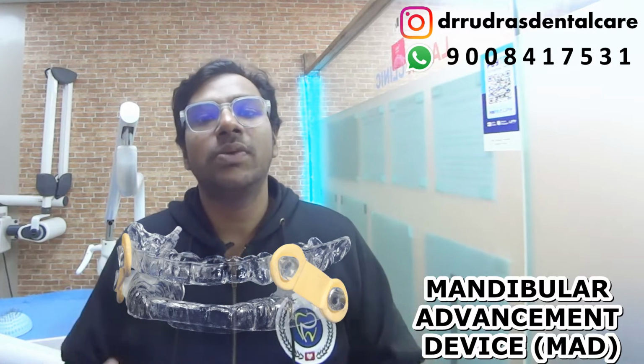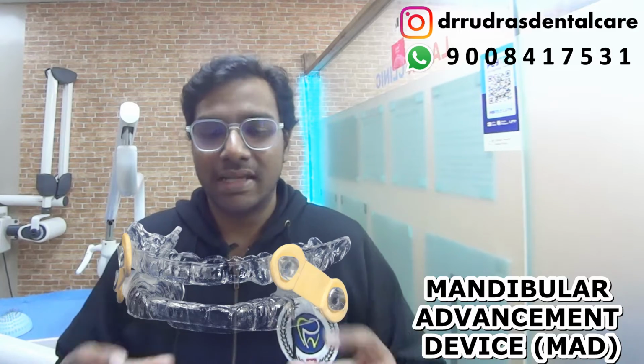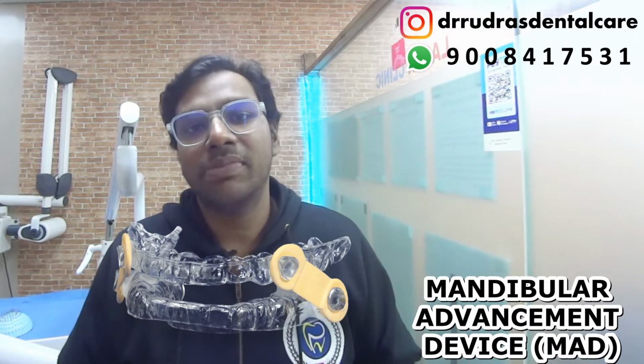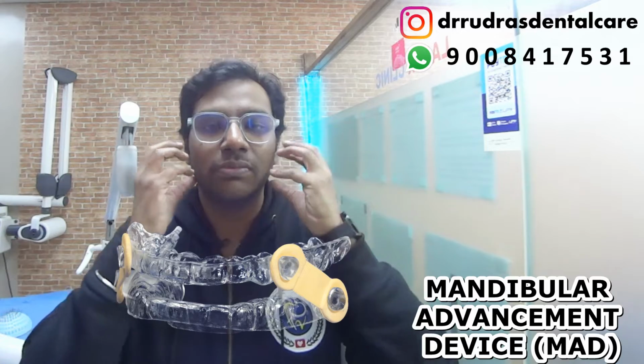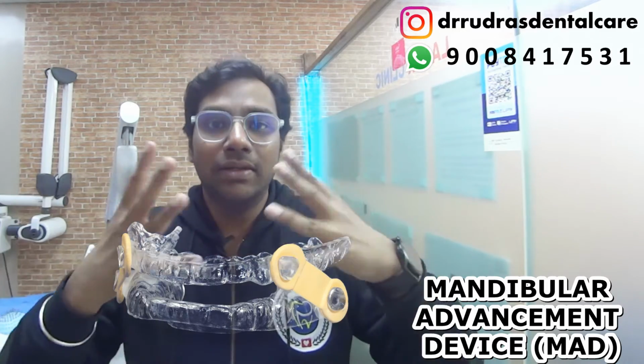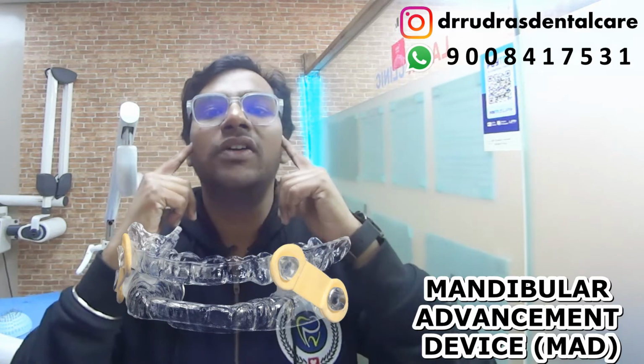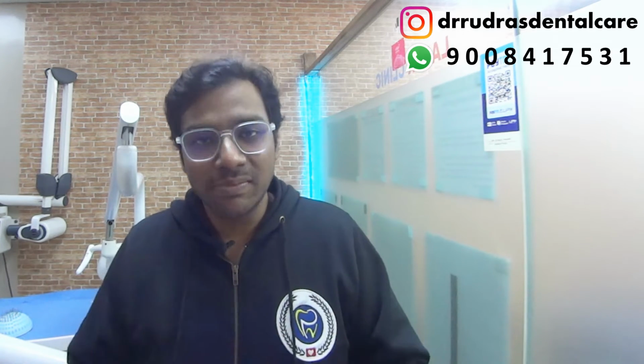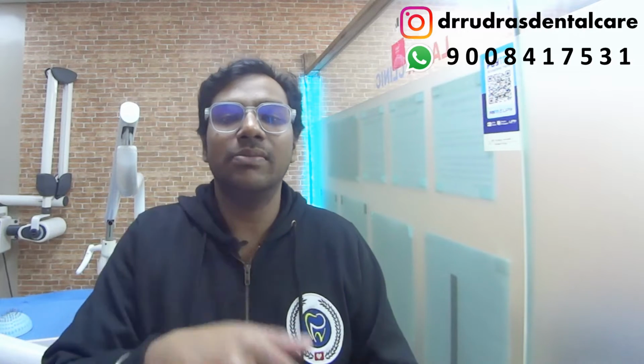Now, mandibular advancement device, as the word says, mandible is your lower jaw, advancement is the advancement, and the device is the device. Basically, what happens is when you're having a sleep apnea episode, most of your muscles relax and then they collapse. Right from your tongue, which can fall back, the roof of the mouth, the back of the throat, and your pharyngeal wall, which is known as pharyngeal collapsibility, thereby reducing the volume of air that can go inside your lungs for respiration while you're sleeping, and that's where the problem happens.